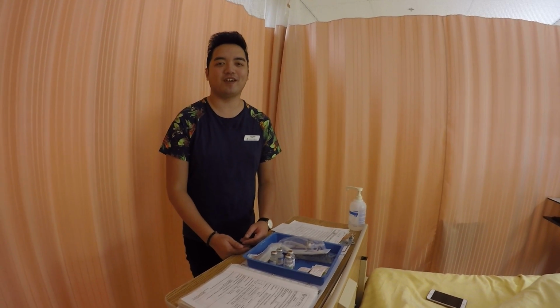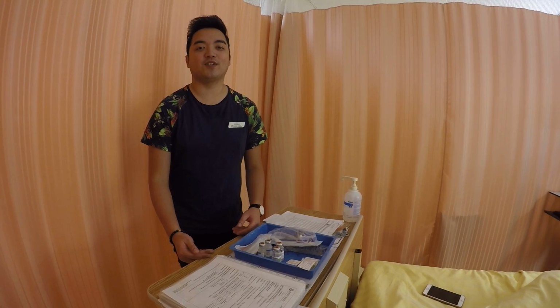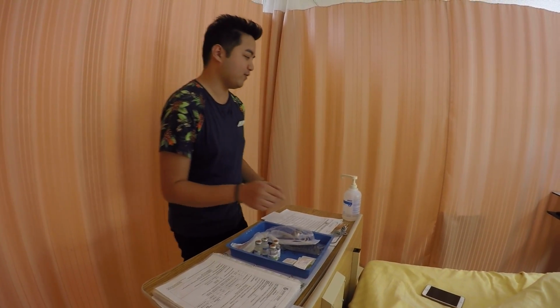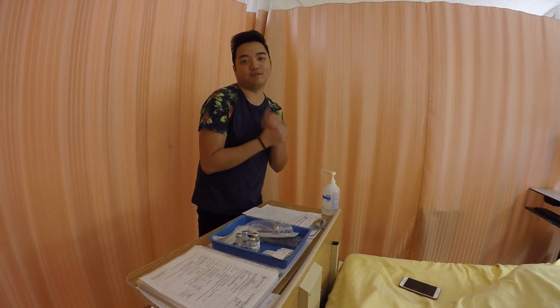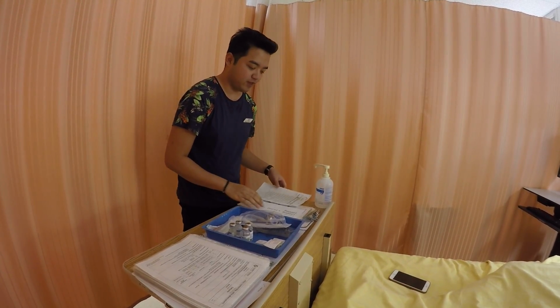Today I'm going to be doing a video demonstration on how to reconstitute, dilute, and give an IV medication through a mini bag. So the first thing I need to do is hand hygiene, that's the most important thing. And then I also need to check the doctor's order and compare it to the MAR.